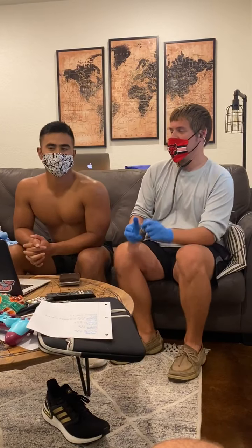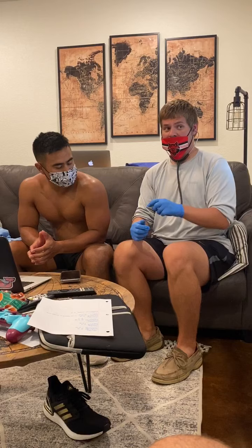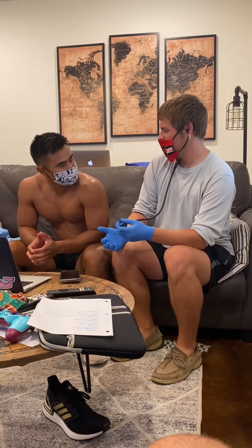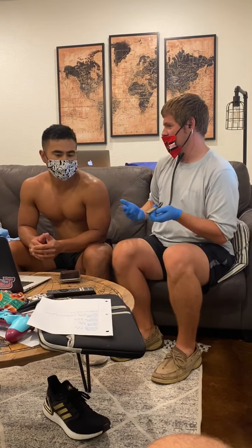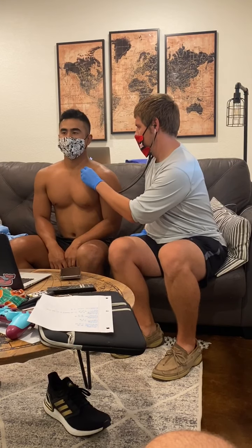And now for these next two tests, we're going to change it up a little bit. For this first one, we're going to be looking for bronchophony. I'm going to do the same thing, but this time just say 99 with each breath. You got it. 99.